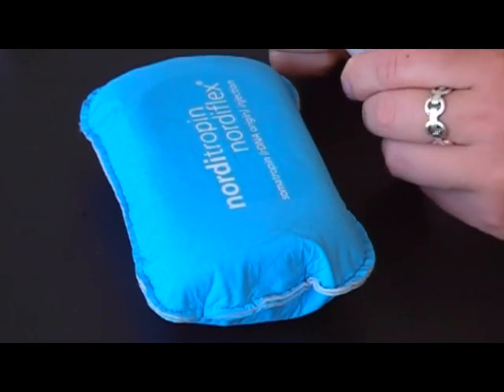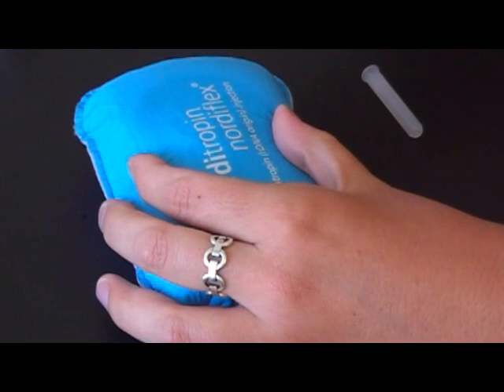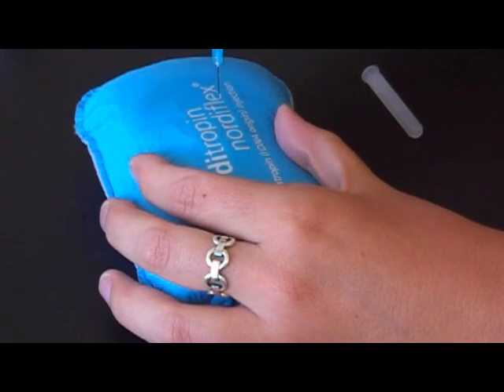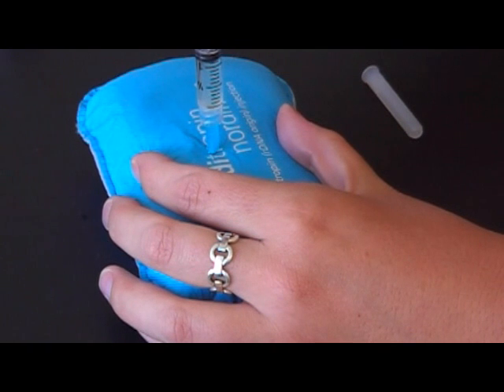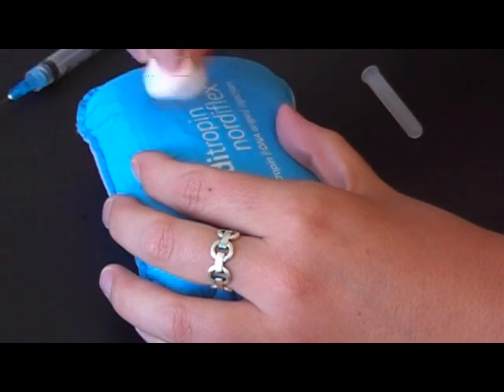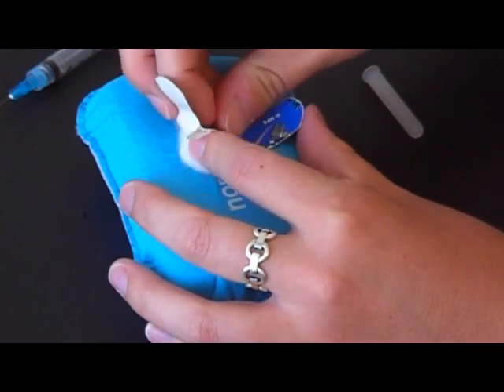Remove the cap from the needle. Hold the needle like a dart, stretch the skin out with your other hand, and inject quickly — if you go slower, they just feel it more. Inject the medication, then pull the needle out. Use your cotton ball just in case there's any bleeding, and apply the band-aid.